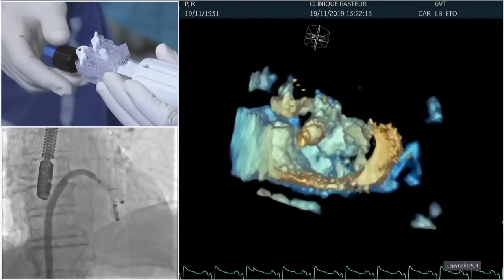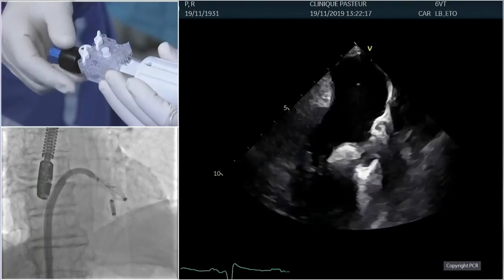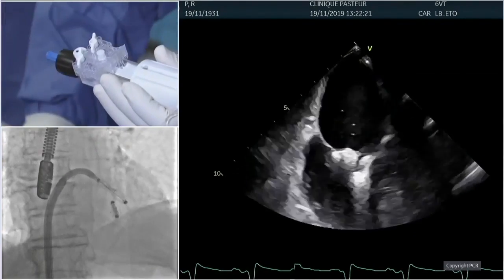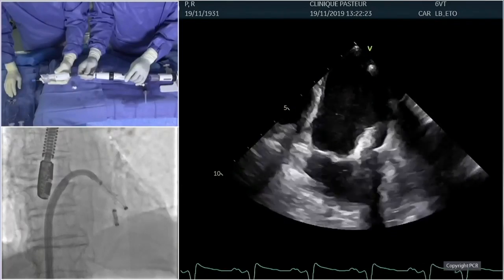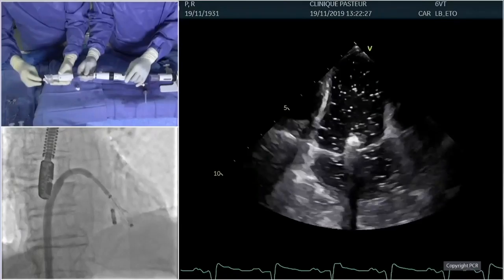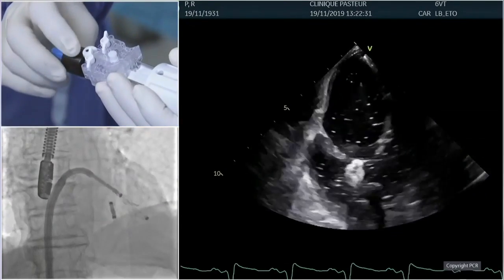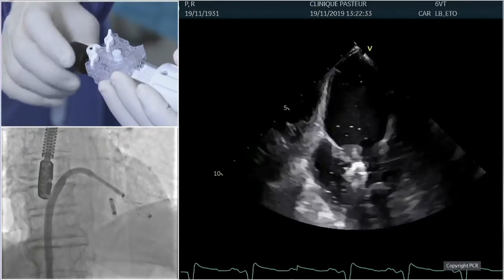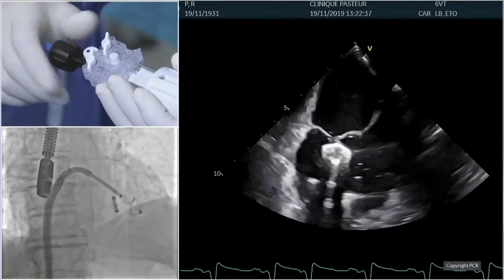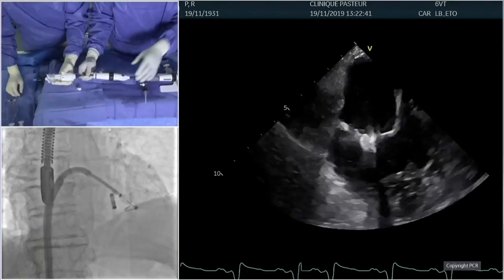And Laurent, can you go back to the free LVOT? Et on va arrêter la ventilation. And stop ventilation. David? Okay. Merci, c'est bien. Okay, good. So we go down elongated, and that's one of the features of the device. We're going to go back to the capture ready mode. Okay, that's fine, a little bit more, Nico. I'm okay with that. And then focus on the LVOT.